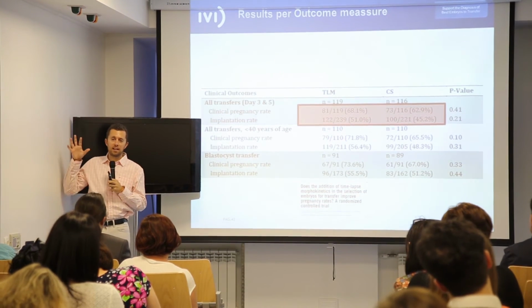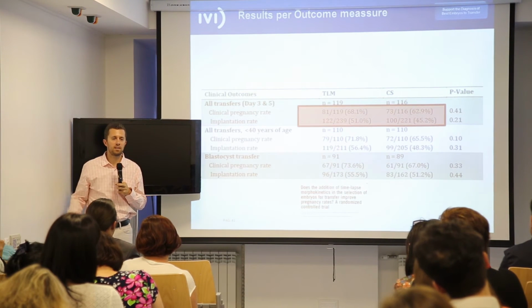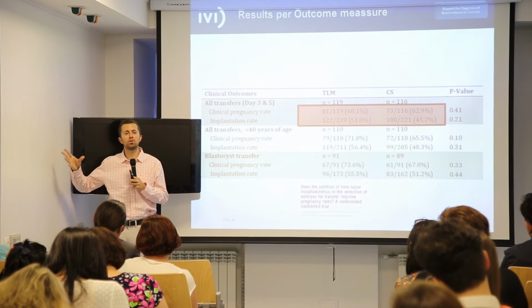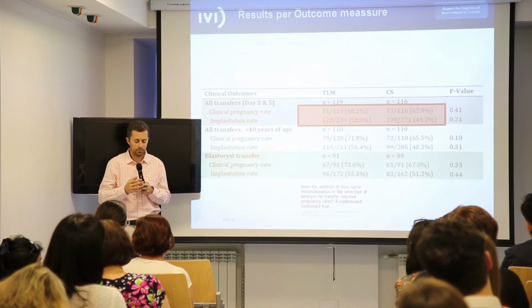If you are on the critical side, you say, okay, time lapse does not work because there's no significant improvement. But if you have this technology in your clinic, and you have a group with 6-7% better outcome, what will you do? Will you use it or not? Probably you will use it. So that was the example.